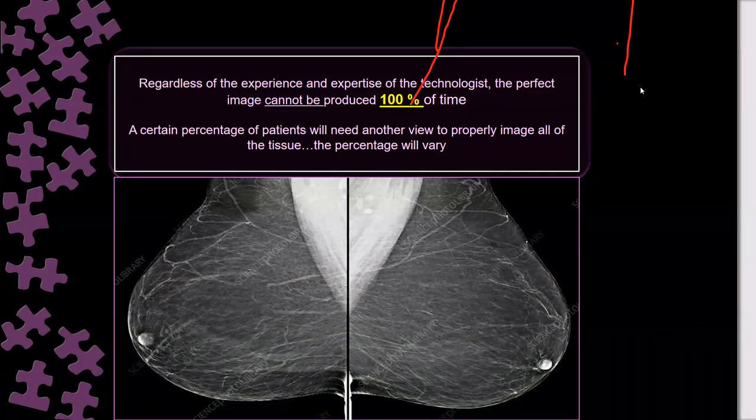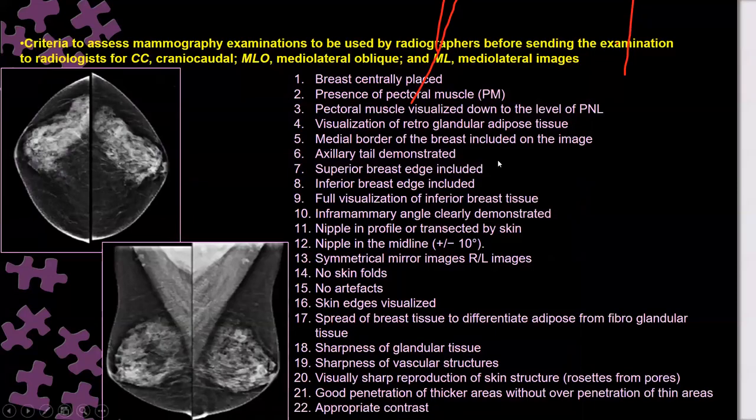Regardless of the experience and expertise of technologists, a perfect mammogram 100% of the time cannot be achieved, and a certain percentage of errors can occur. So we can judge: is it an accepted mammogram or not an accepted mammogram? And this whole list should be reviewed by the technologist before sending the image to the radiologist.